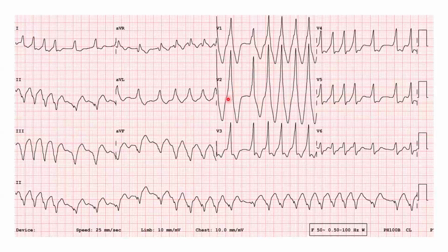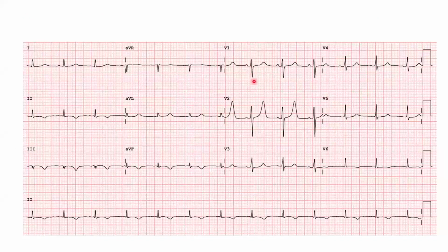In this patient, again, during sinus rhythm you don't see any pre-excitation, as the pathway is in the left lateral, which is far away from the sinus node, and the preferential conduction in this patient is via the AV node.